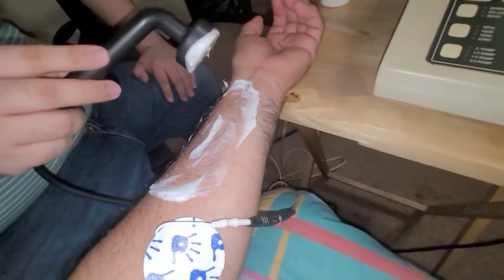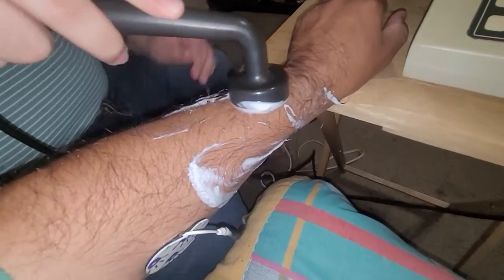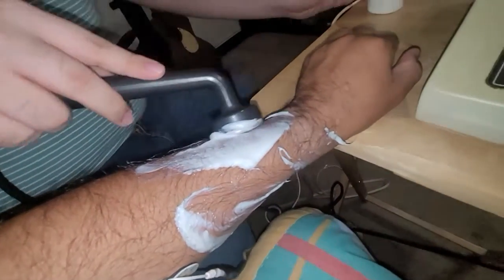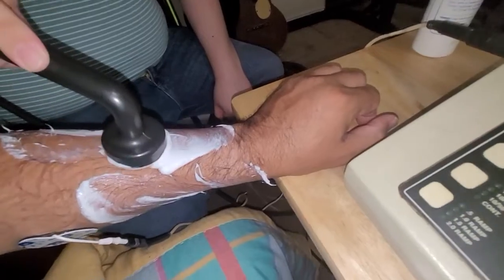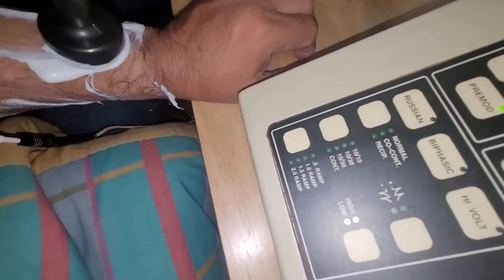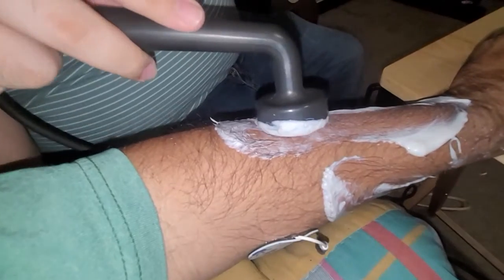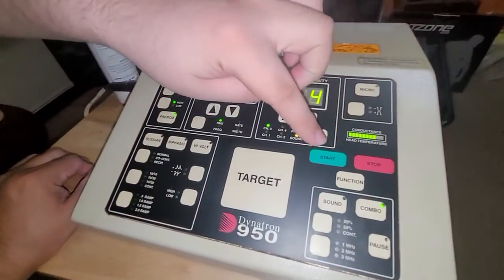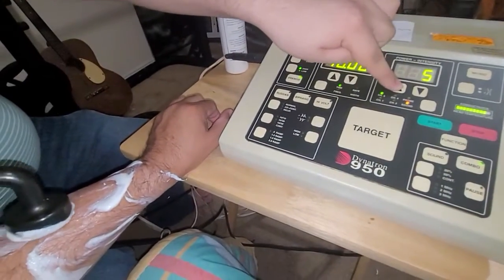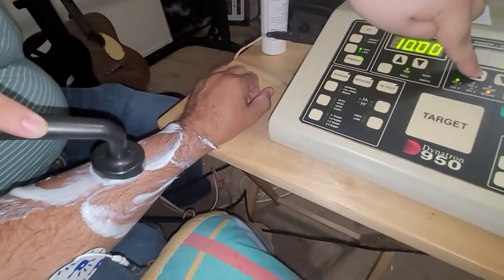actually we're going to be doing it on the other side of the forearm. Just go ahead and wipe that over it. Go ahead and put some more lotion on there. And now it's... Can you go ahead and push the power button as you're doing that? Pointed towards it. Start button? Yeah, it's actually the up button. There you go. Yeah. So there's 5, 5.5, 6, 6.5, 7.